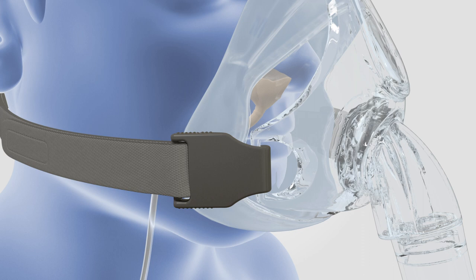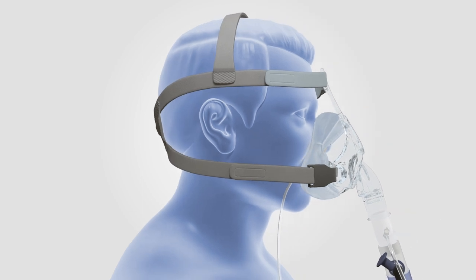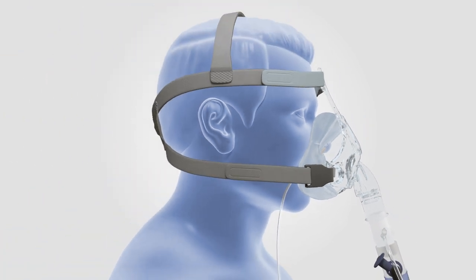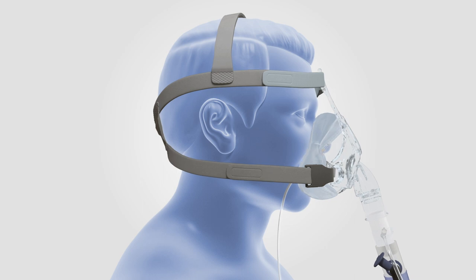Adjust the chin straps of the headgear. Don't over tighten the headgear straps, as over tightening may cause patient discomfort or leak. Gently pull the entire mask forward, allowing the seal to inflate so it can adjust to the patient's face to minimize leak. Gently release the mask. Readjust headgear as required and remember to gently pull the mask forward to inflate the seal. Repeat until comfortable with minimal leak.